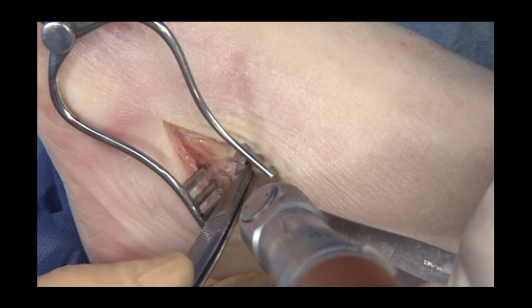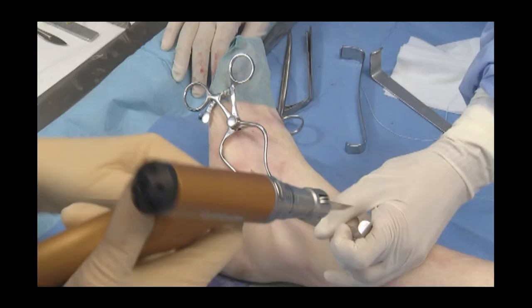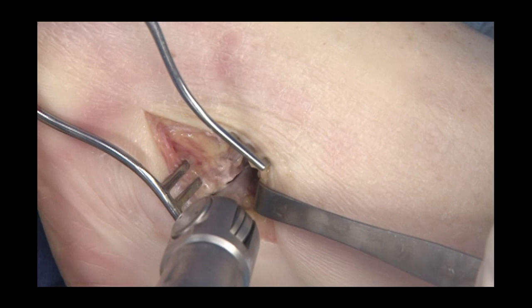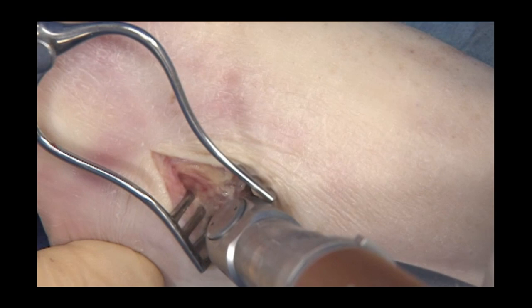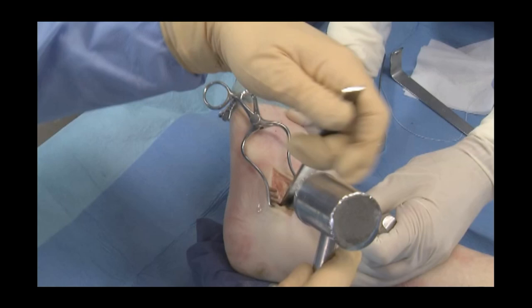Once forceps orientation is checked, it is used as a cutting guide. Bone cuts are completed with respect to the medial cortex — one can see the saw knocking on. The osteotomy site is opened with an osteotome, bending the medial cortex until correction of the deformity is obtained.